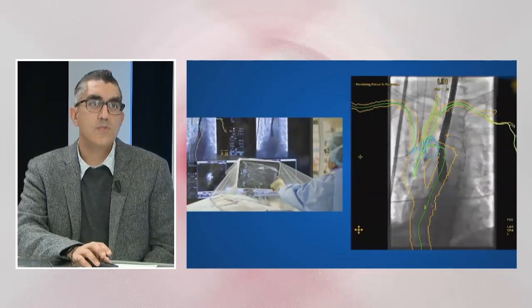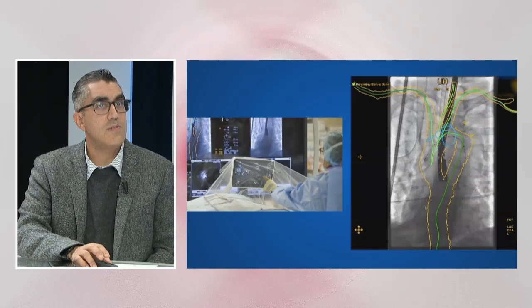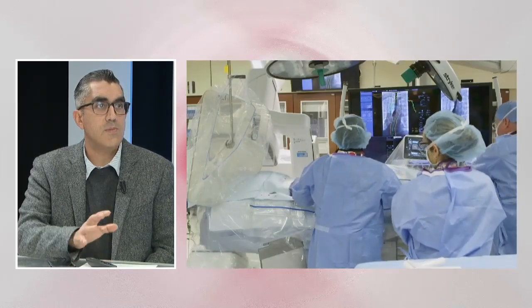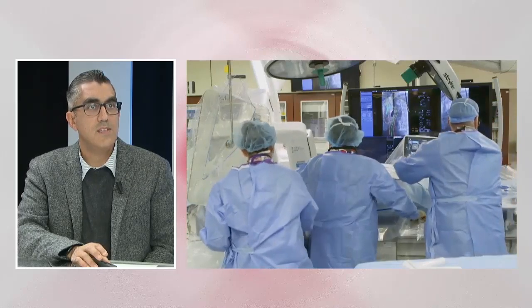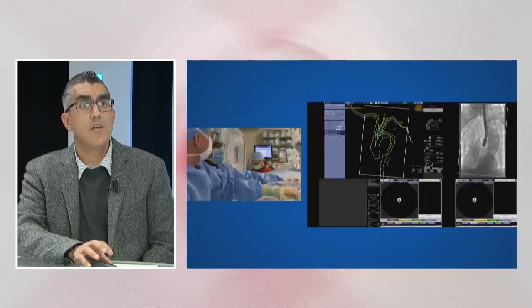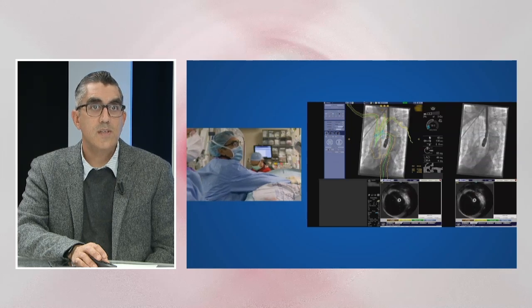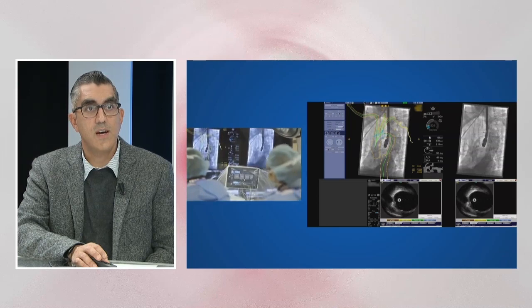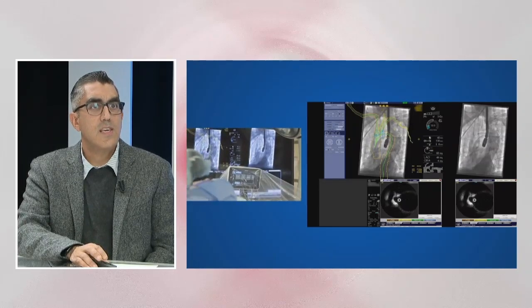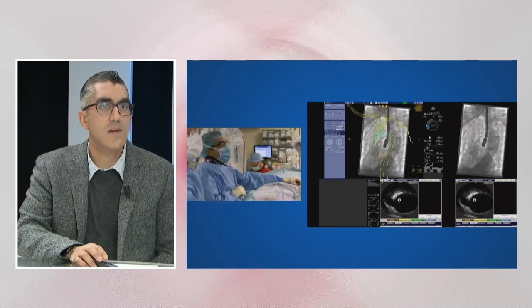We're going to superimpose images here. The registrations aren't always perfect, and I think this speaks to the dynamic nature of the ascending aorta and arch. But as you can see, these images are easy to register. We're swinging back and forth at 90-degree angles to accurately align our images with our surgical plan. The green line is the wire in the true lumen — you can see how our wire follows the green line. The IVUS is there mostly for backup as we do these early cases to ensure patient safety. Once registration is done, it is very accurate.